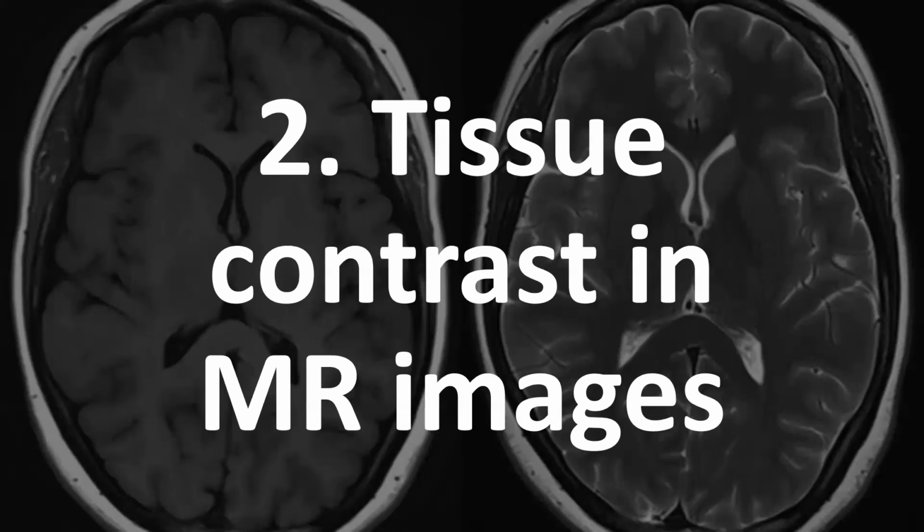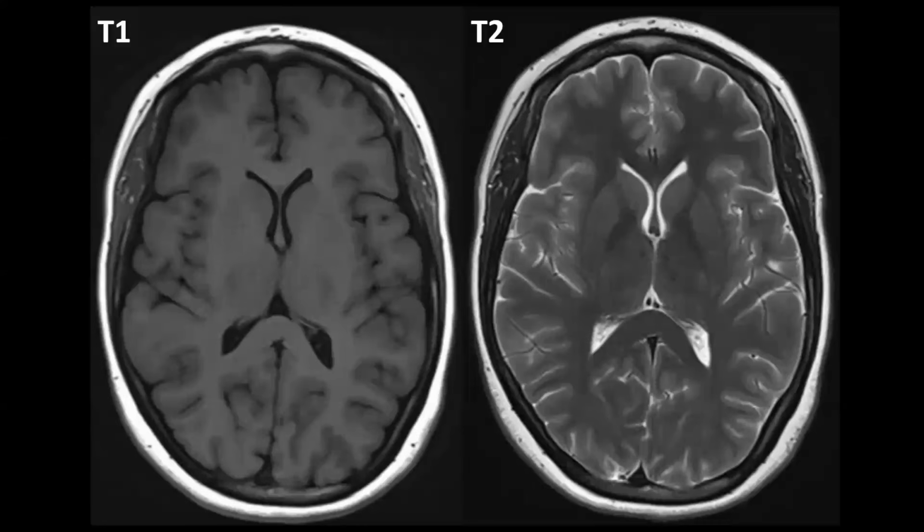I want to talk about tissue contrast, because when I said we use this to create an MRI image, well, there are a lot of different types of MRI images. We have T1 weighted sequences and T2 weighted sequences, which are the workhorses of MRI images, and basically most of our sequences are derived from that, to put it simply. But what makes these sequences different? Why do these images look different? The basic principles are the same. What makes them different? Let's talk about that now.